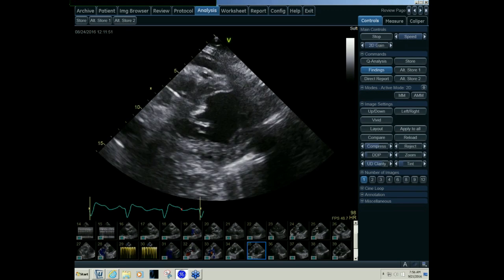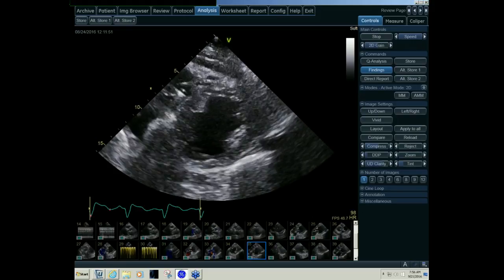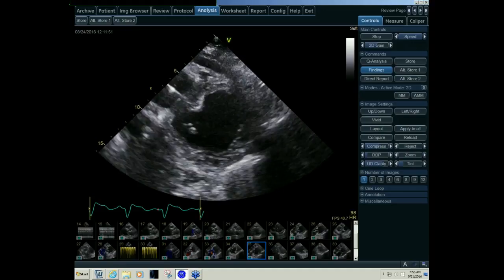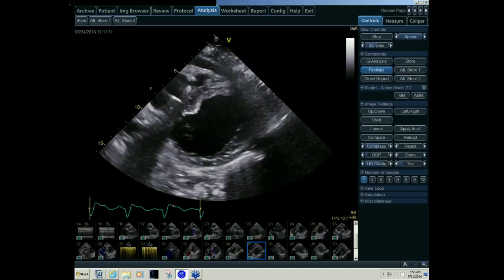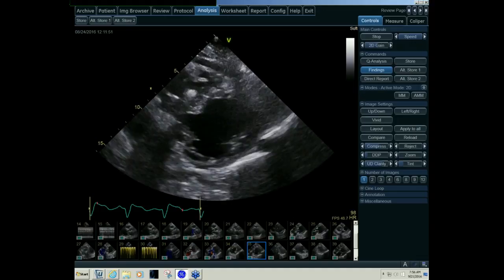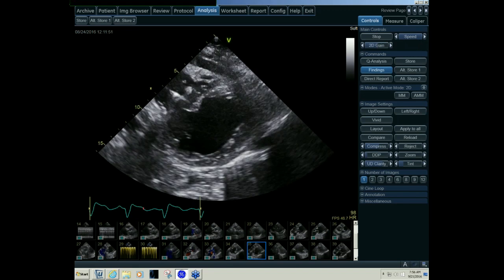So we saw that there was no significant mitral regurgitation and there was no mitral stenosis. And now again we see the ventricle looks pretty decent. It's not normal, it's dilated, it's not beating entirely normally, but it's good enough to keep her out of the hospital. She hasn't been hospitalized for congestive heart failure since then. So we broke the cycle. We were successful.